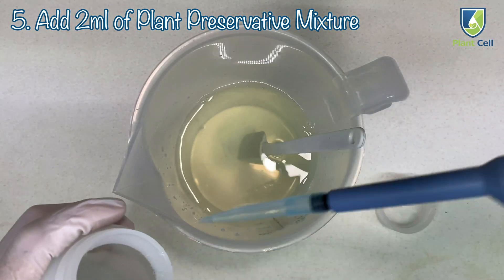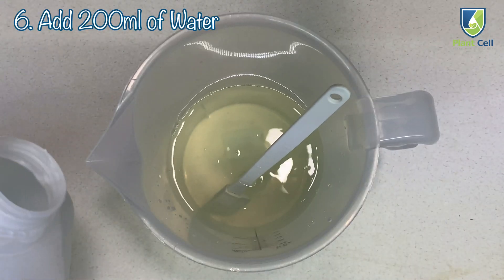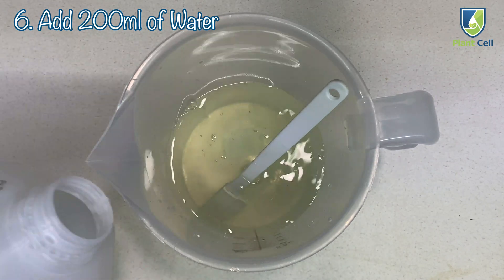No contaminants, no bacteria. It'll grow up nice and strong. Then we fill up the rest of the pitcher with 200 ml of water.